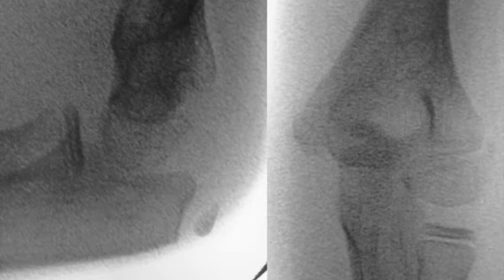Herein, we present an illustrative case of our technique in an 8-year-old child. The patient had a range of motion of 10 to 100 degrees preoperatively. These figures demonstrate the sagittal plane deformity with the fracture healing in extension. The contralateral side is supplied for comparison purposes.